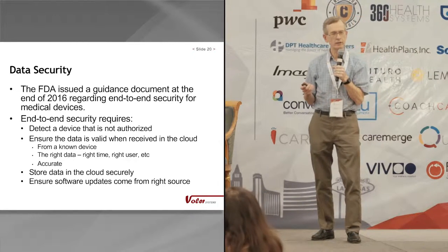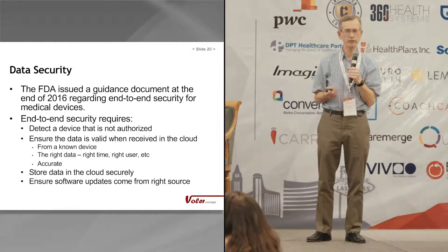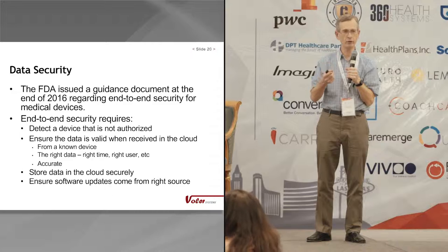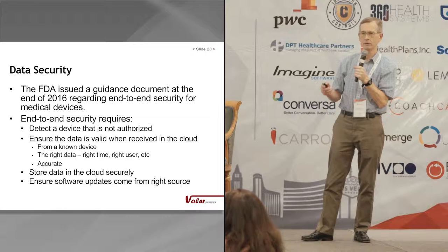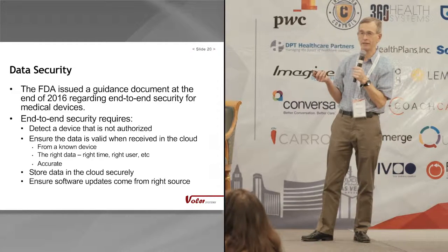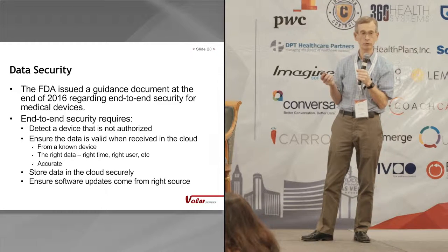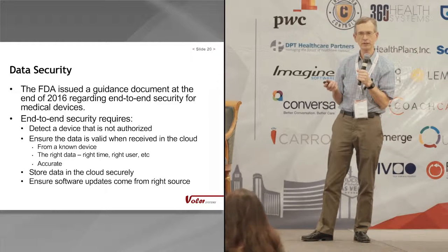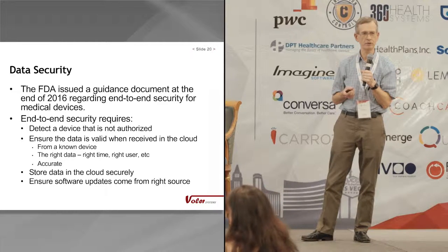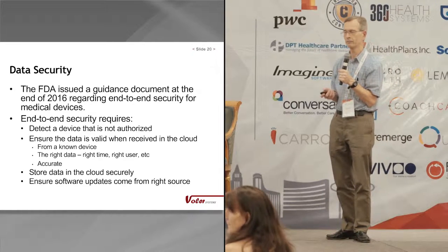Another way that you can have a security problem, a lot of devices are updated over the air. Well, if I can update it over the air, maybe you can too with some other software. That's a big security problem. So since it's a guidance, this isn't something that's optional. This is something that if you don't have, you can have a real problem if you get a security breach. So it's no longer optional, but I don't see it becoming as big a deal as I think it should be. But the large companies are definitely worried about it.